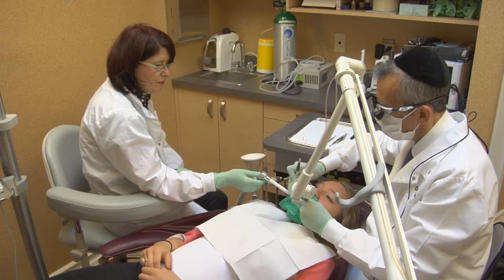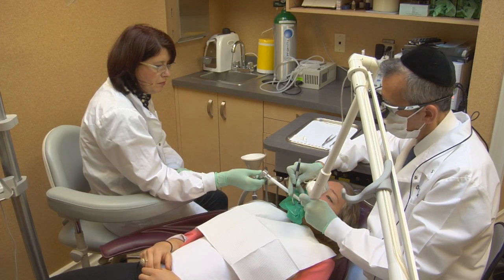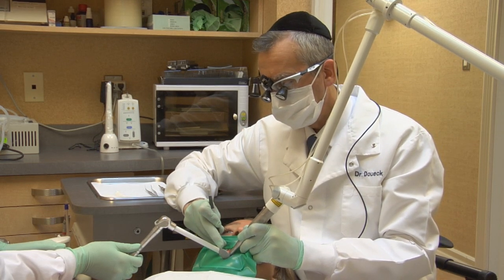A vital pulp therapy, as the name implies, requires that the nerve be alive. If the nerve has already died, if the infection has already spread into the bone, this can't be done. But if the nerve is still alive, even if the decay or the fracture has reached into the nerve tissue, we can do this procedure. What's used is ozone, a medical disinfectant. We're using ozone gas, and we use ozonated water to completely disinfect the insides of the tooth.